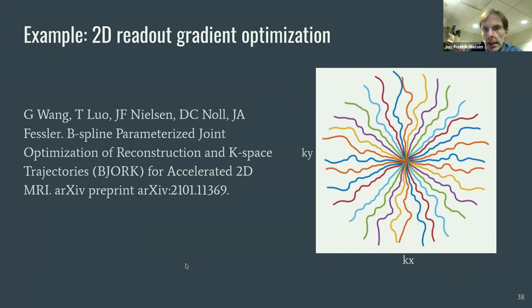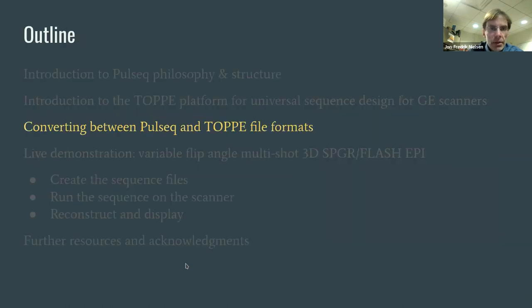that we were able to play out, because we can load essentially an array of waveform shapes into each .mod file. So it's very, very flexible for doing a variety of things. So that is just to give you a very, very brief sense of what it can do.